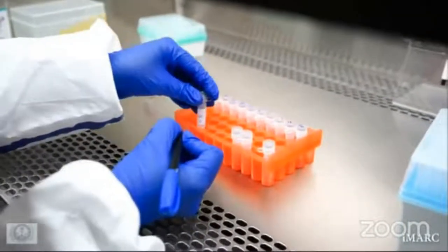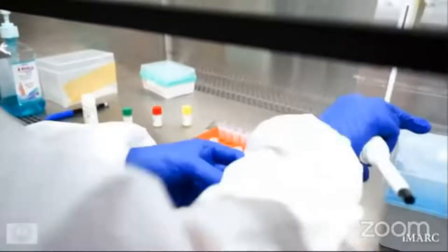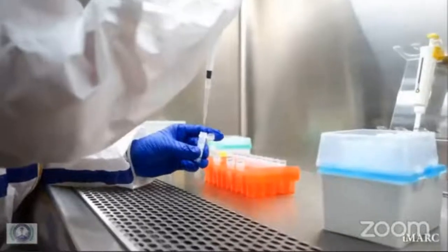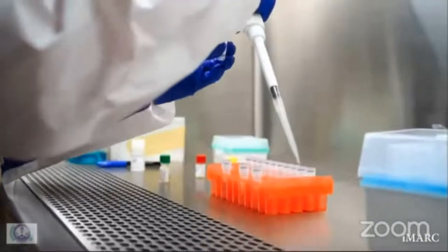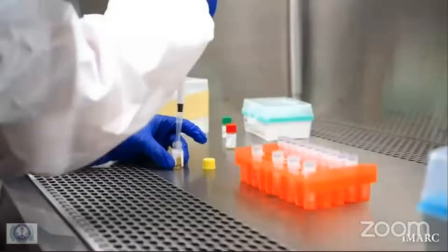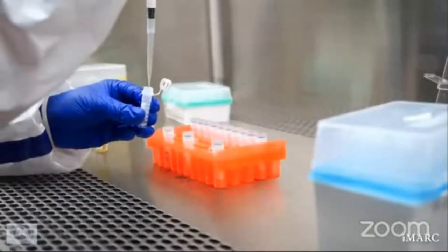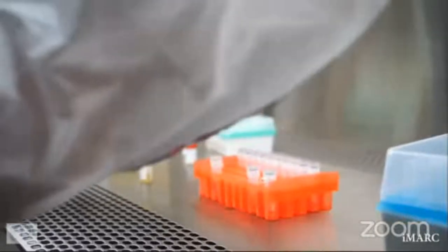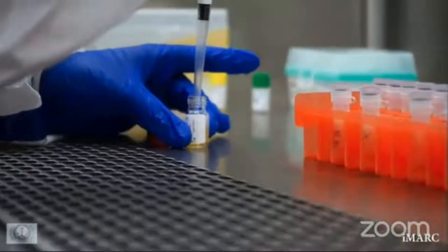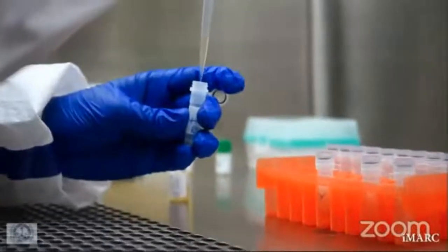The first step is the sample pretreatment, in which we pipette out 300 microliters of the test samples along with the controls into 1.5 ml polypropylene tubes. Then we add 100 microliters of sample pretreatment solution R7 to each tube. R7 is the sample pretreatment solution, which consists of EDTA solution. EDTA is a chelating agent which removes metal ions from the samples, and it also denatures the protein complexes present in the sample.